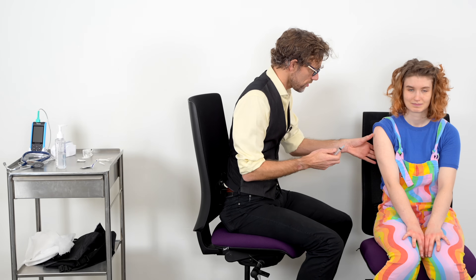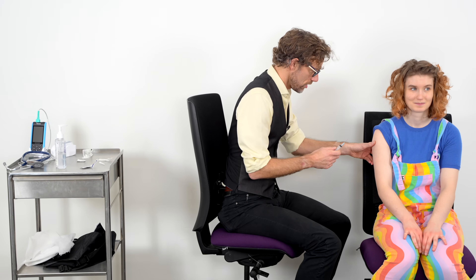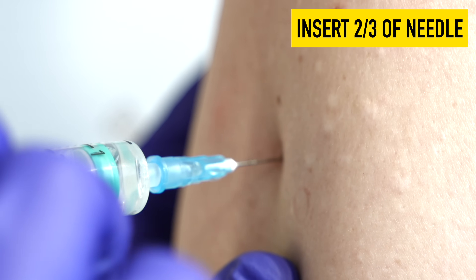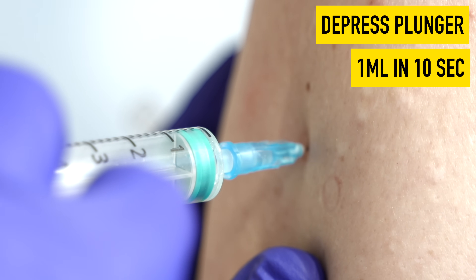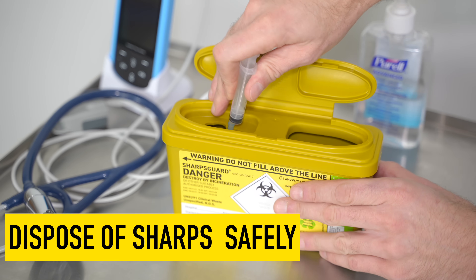So in terms of the injection, I'm just going to pull down on your arm — just try and relax, keep it loose and floppy. I'm just putting a bit of traction on, and just going in, and just pulling to see if there's any flashback. Okay, and then relax.